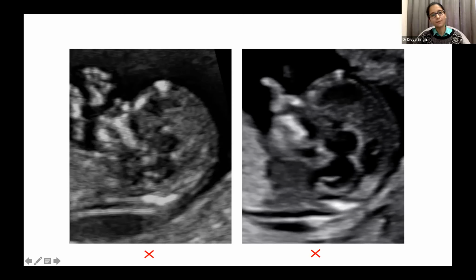And this is again a hyperflexed NT. You don't see any amniotic fluid between the chin and the chest. This would result in underestimation of nuchal translucency measurement. This image is not acceptable.